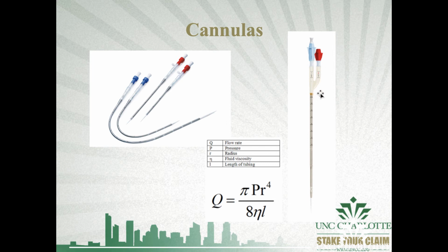And what do you think are the benefits of using a single cannula? You have less insertion sites, you have less chance for infection, and so on and so forth. This would be in a VV configuration. So what you would do here is you would insert this cannula into the patient's IJ, you'll go down into their IVC, and you will situate it there and target or point one of these ports at the patient's tricuspid in the right atrium. All right, so you're sucking up deoxygenated blood, it's going back to the pump, and you're being reinfused with your oxygenated blood, and it'll come out this way into your heart, okay?